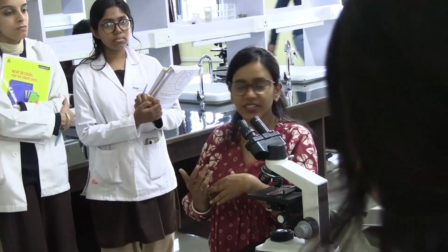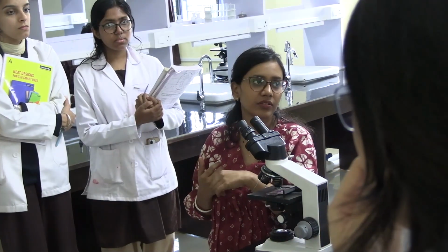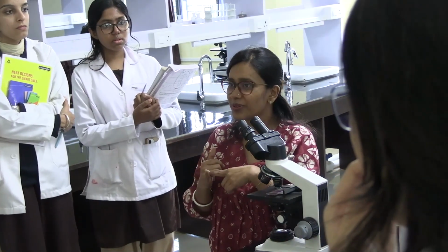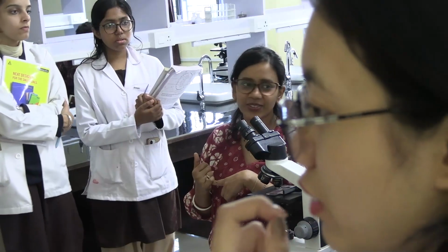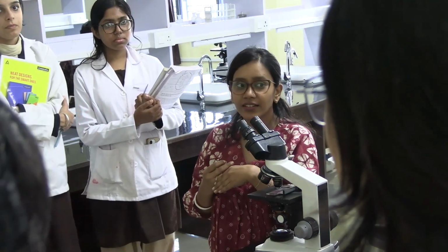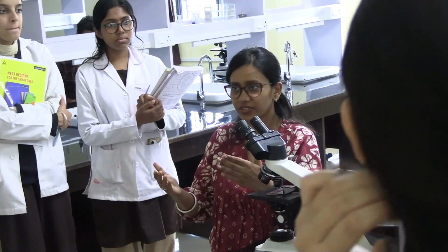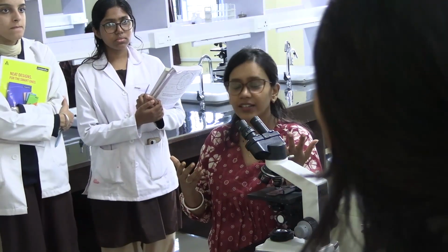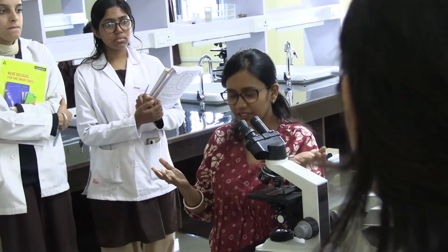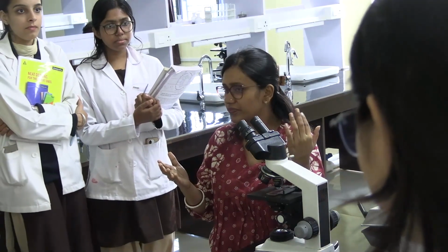What do we have in uterus? Normal histology, you tell me. I'm not talking about epithelium. Tell me the structures. Mucosa has what? Glands. Yes, glandular epithelium. Okay, so adenocarcinoma arises from glandular epithelium.